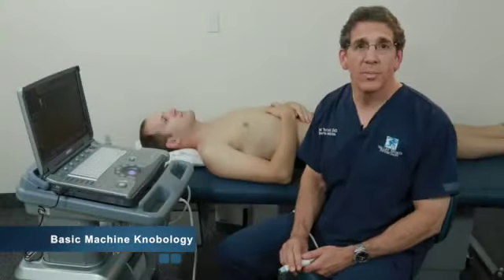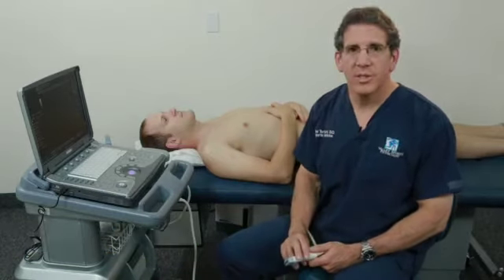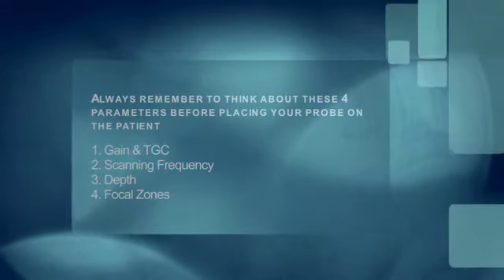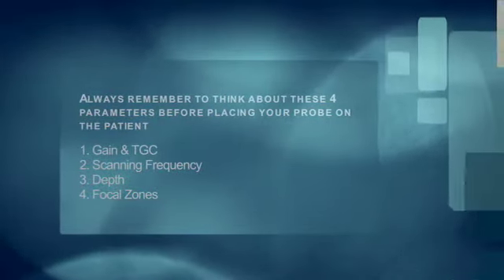Next, let's talk about machine orientation and machine settings. With most machines, there are at least 4 settings that you want to become familiar with: gain, scanning frequency, penetration or depth, and focal zones.